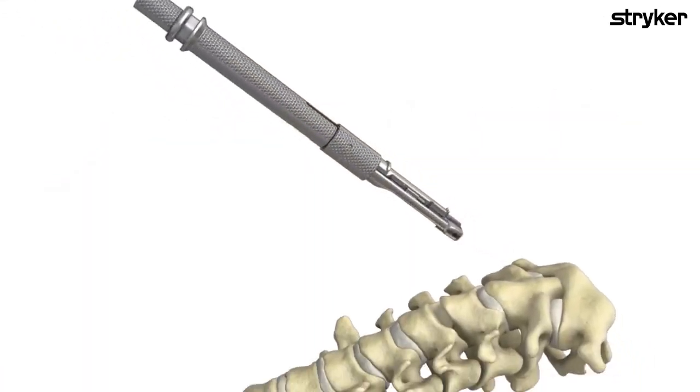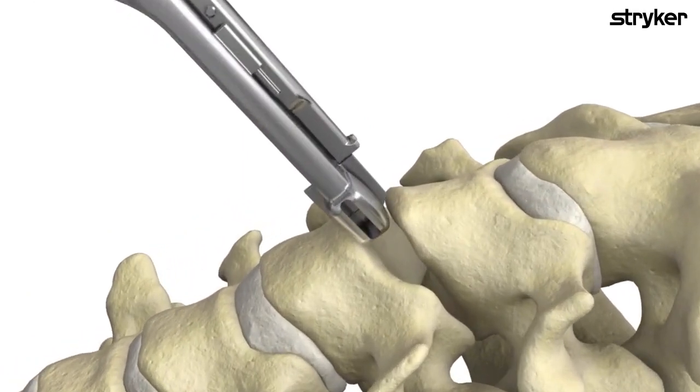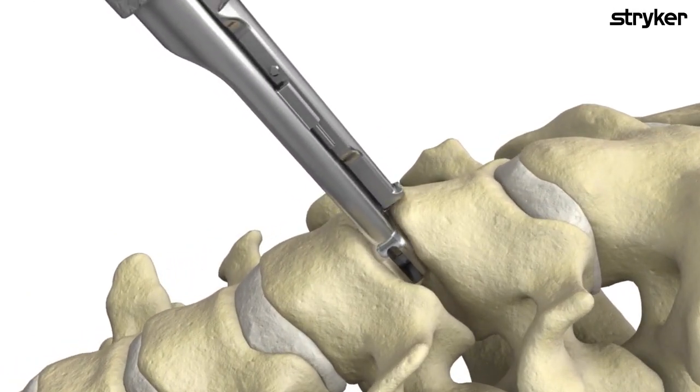Trials match the disc size to ensure an accurate fit. Gradually increase trial size until a secure fit is achieved. A properly sized disc should be securely seated between the end plates when the segment is appropriately distracted. If desired, a disc spreader is available to aid in distraction.